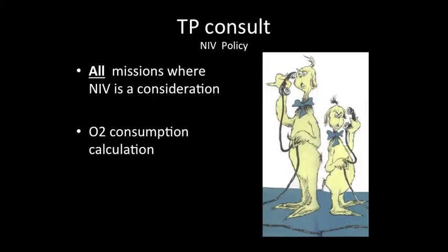The transport physician must be consulted on all missions in which non-invasive ventilation is being performed or considered. Consultations with the transport physician should include discussions regarding oxygen consumption. Ideally, the air medical crew and transport physician will perform the oxygen consumption calculation together to determine oxygen demands and transport time limitations, ensuring appropriate transport decisions.